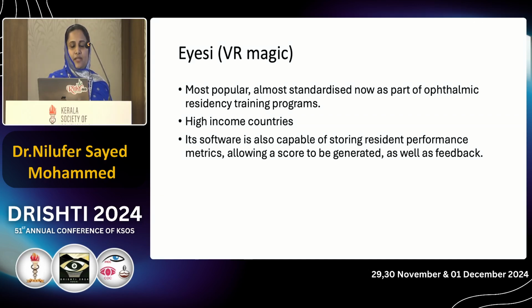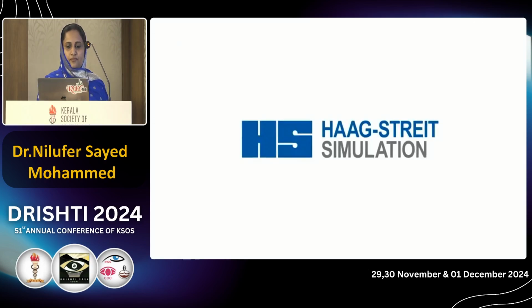EyeSi, this is the most popular VR simulator training program that's available, and it is almost standardized in Western countries, and it's part of the ophthalmic residency training programs in US. It's used in high income countries. You can practice all the steps of cataract surgery, and also VR surgeries can be trained using this. Its software is also capable of storing residents' performance metrics, allowing a score to be generated as well as feedback. We can watch a video.